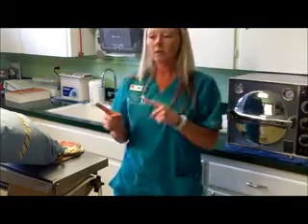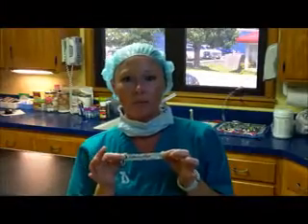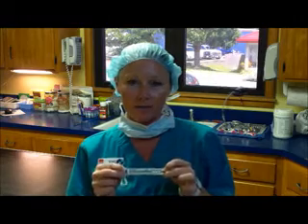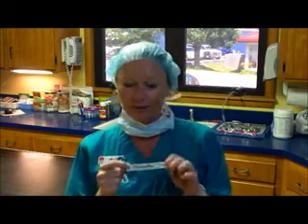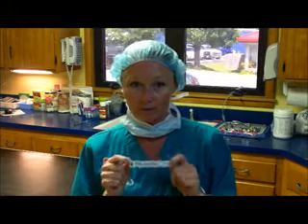Once the doctor opens the pack for the procedure, I will show you the strip inside. This is the indicator strip from the pack that was wrapped. I could not take a video of the surgeon undoing the pack because it was in surgery and the video camera would not fit in there. But here is the indicator strip that came out of that pack.